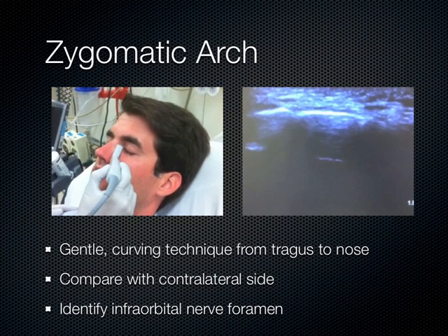And once in a while, you'll see that infraorbital nerve foramen drop down, and it's pretty easy to make out. So the infraorbital nerve foramen, where that nerve pops out, is a common place we do nerve blocks when we're doing painful things to people's faces in the emergency department. We find that infraorbital nerve foramen and bring a needle down to it and block up that nerve.